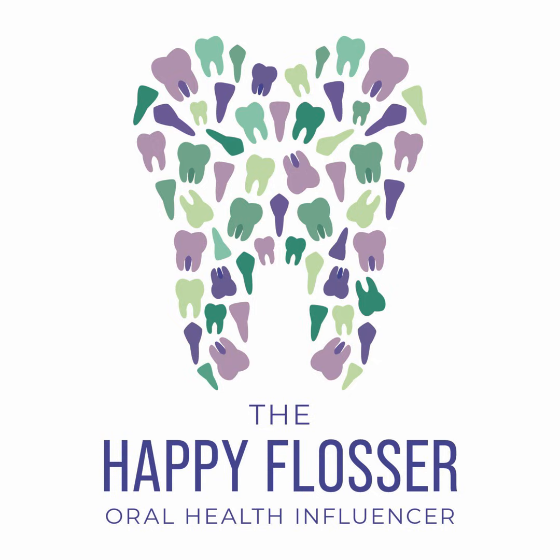All right. And then the other thing I just want to share with you guys is that when you're doing your radiographic interpretation, you want to make sure that you have a process that allows for a comprehensive evaluation of the entire dentition. You don't have to follow the same order that I shared that I do, as long as when you are completed with your radiographic interpretation, you have looked everything over and everything has been evaluated and documented by you.